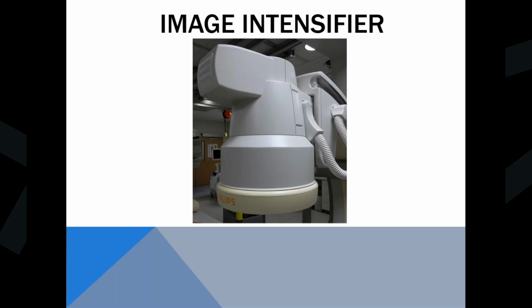Now this image intensifier is huge. It's probably the biggest one I've ever worked on. It can do a full body scan if they're doing a peripheral scan. And for a CCD camera, this thing's huge. Like I said, if you imagine the little OR C-arms that have these, they're like this, where this is the size of a small CRT TV or monitor. So this was pretty much the conventional way for them to make fluoro and cine images up until, like I said, the early 2010s.